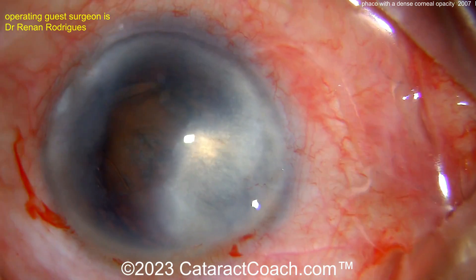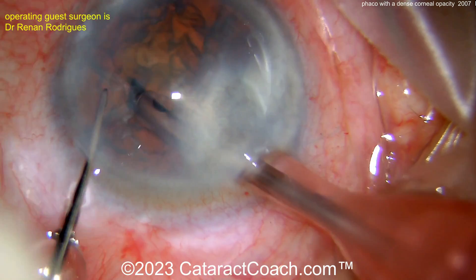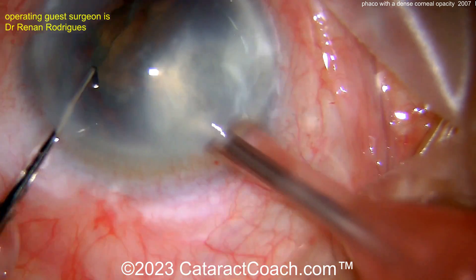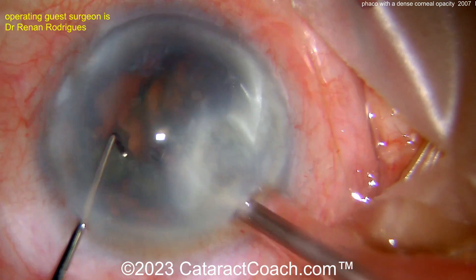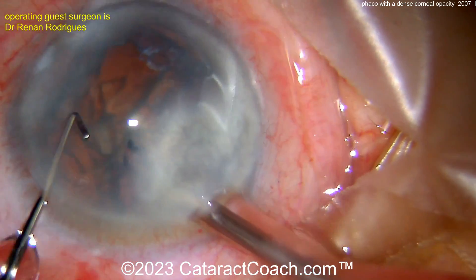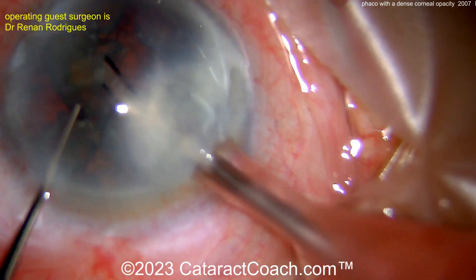Some good hydrodissection there. There's some more viscoelastic to protect what's left of the cornea. Now here comes the phacoprobe. By making the phaco incision where the scar is, that was smart — because now you operate in front of the phacoprobe tip, not behind it. So the critical area where you're operating is unobscured — that's the clear part of the cornea. That really was a great idea.